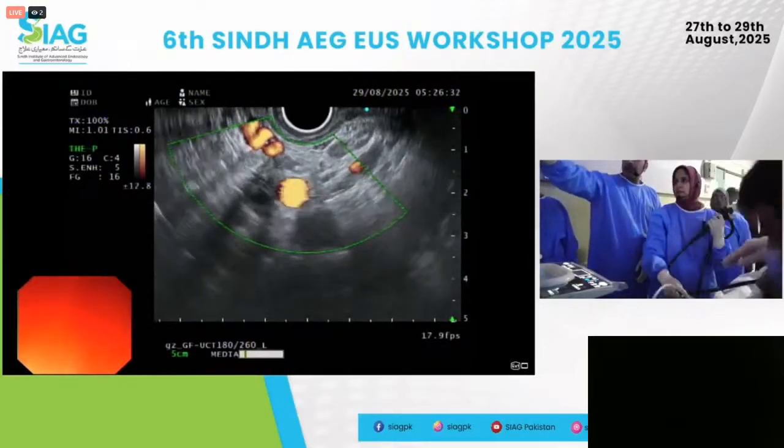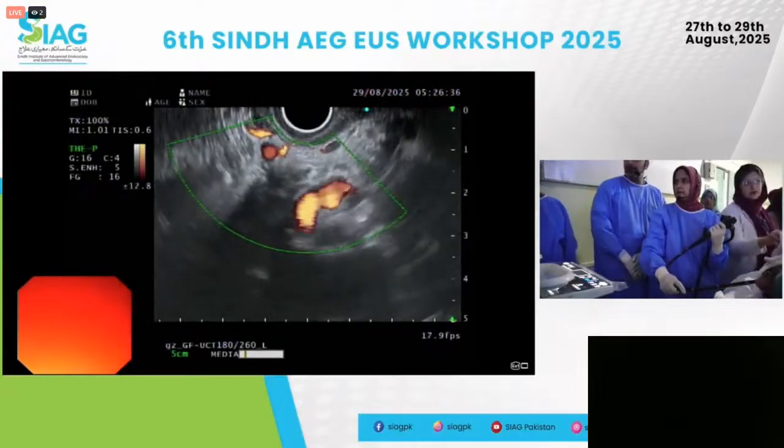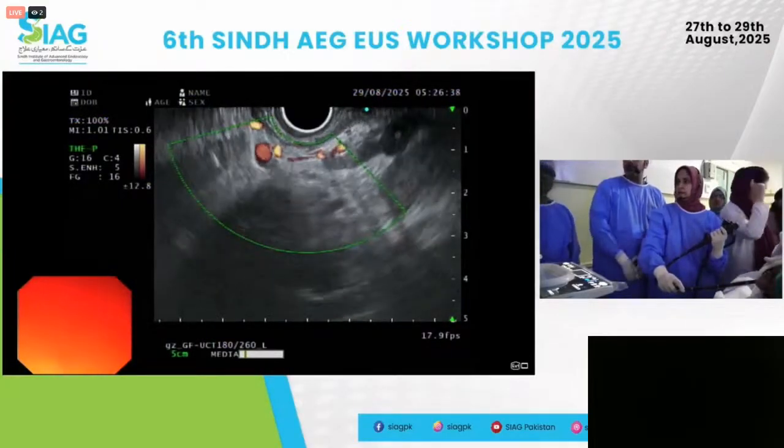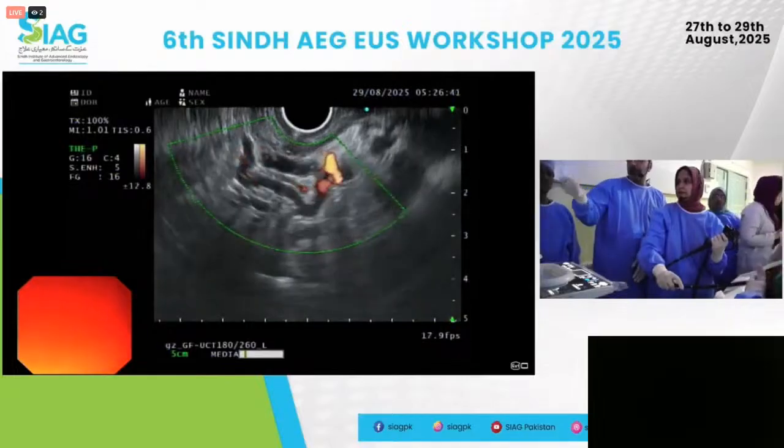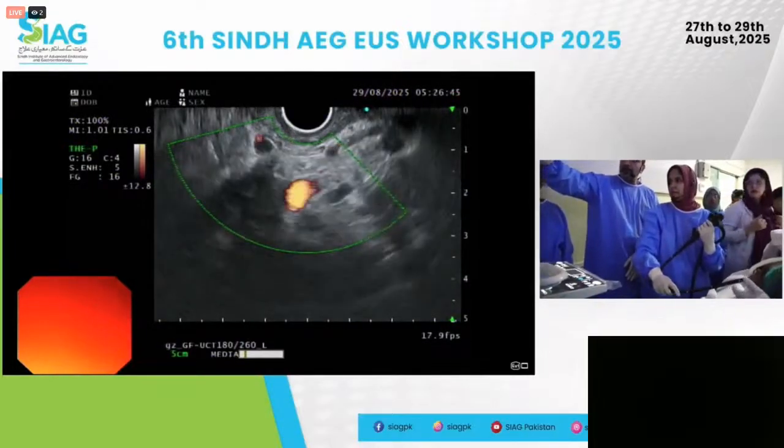So now when it goes down, you have to slightly big wheel towards you, and keep going big wheel towards you to keep it in view, and keep going clockwise. So you're right about there, you lose it. So you bring up a good point about potentially there being collaterals.